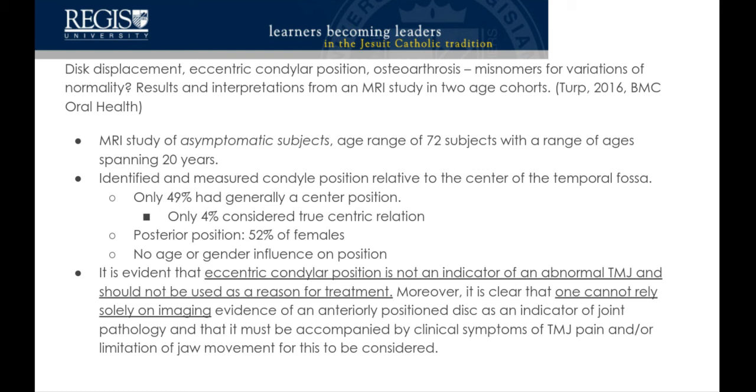And this study showed that an MRI of asymptomatic people, all with more advanced age, showed that very few of them actually hit that true centric relation. Why that's still considered normal when hardly anybody meets that definition is perplexing to me. I think it's just convention. They've used that definition for decades and decades, and so they keep using it because that's just the way it's always been.